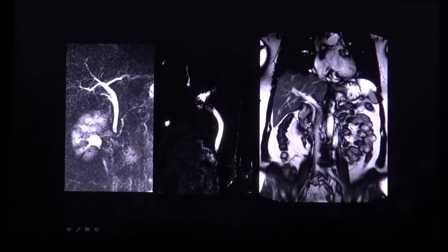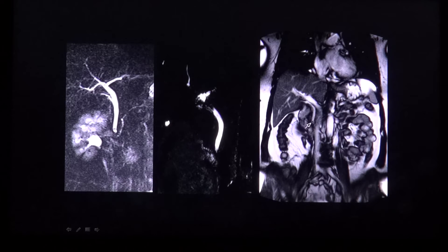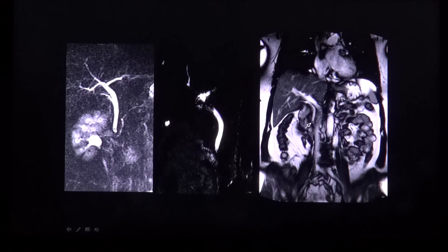The gold standard for detecting stones in the common bile duct is the ERCP, which stands for endoscopic retrograde cholangiopancreatography, where stones are seen as radiolucent filling defects.